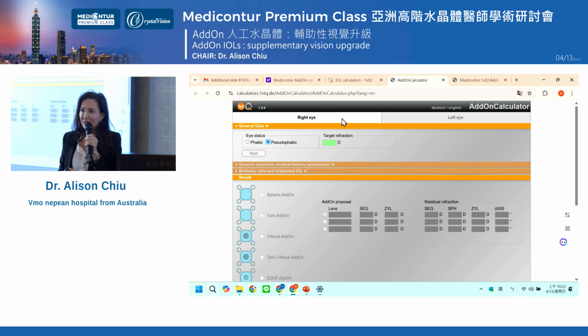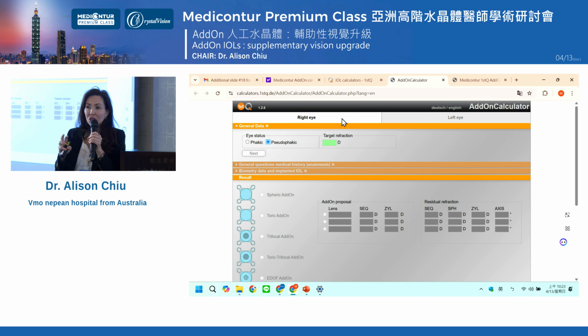We joke sometimes some things take so long inside the eye, like not these lenses, but some other lenses take so long you can go make a cup of tea while things are happening in the eye. So I just didn't include it in the video. But yeah, I think it's useful to bring the pupil down just to make sure that you don't get any capture of the edge of the optic, because these eyes usually have a lot of dilation before their cataract surgery. I agree. Thank you for bringing that up.